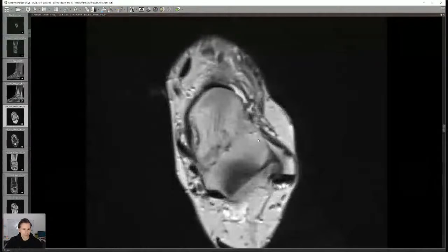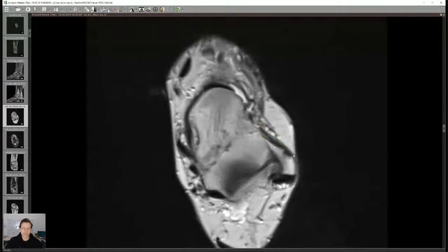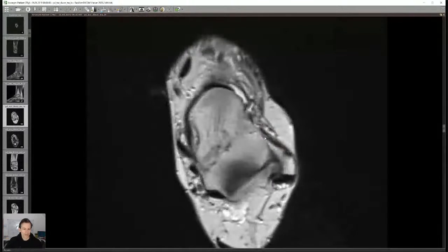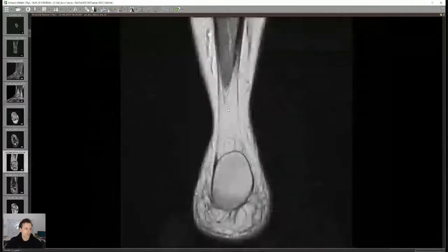Be mindful that ligaments have a lot of different appearances — don't overcall signal abnormality as a partial tear, especially not in an acute setting. This here is the anterior talofibular ligament, and the second lateral ligament is this one.